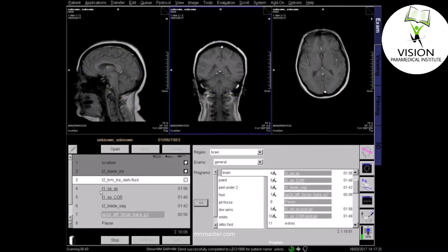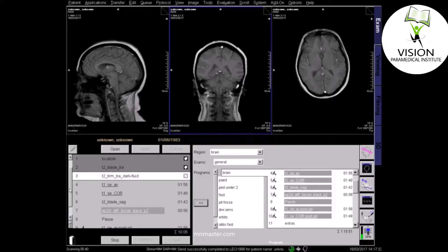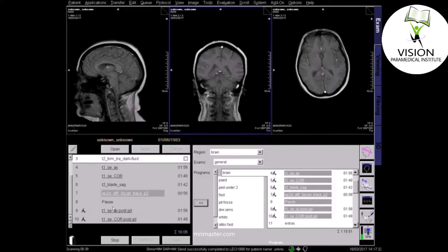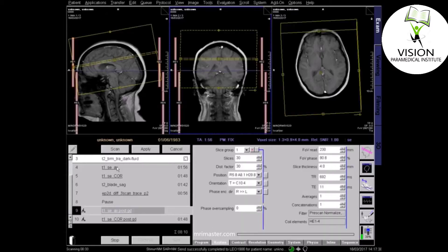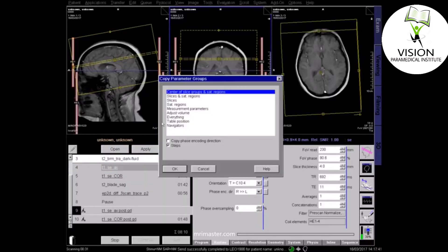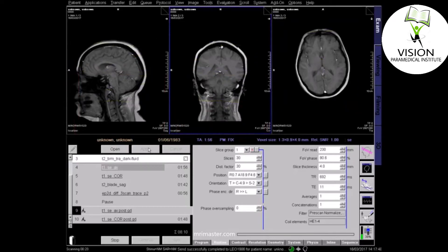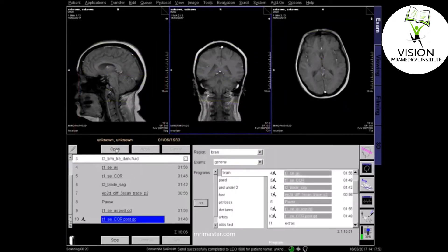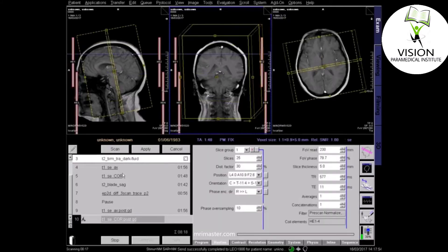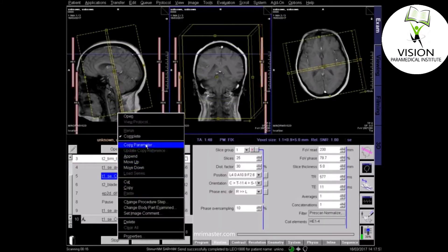If the radiologist has requested a gadolinium injection, it's essential to check the patient's kidney function in line with national and hospital guidelines. Only proceed if it's safe to do so. When planning the post-contrast sequences, axial planning can be copied from the precontrast T1 sequence, and the coronal post-contrast sequence can be copied from the precontrast T1 coronal.